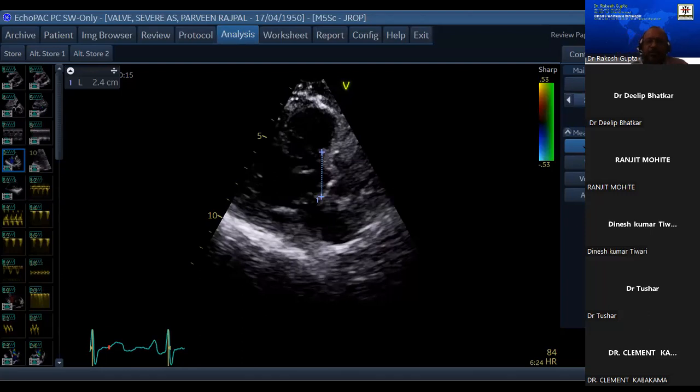Good evening. I gave you three variables for aortic stenosis. What are those three variables? Sir, LVOT diameter. Correct. And sir, LVOT VTI and aortic VTI, sir. So how do you calculate aortic valve area now? So we will do it by the continuity equation.